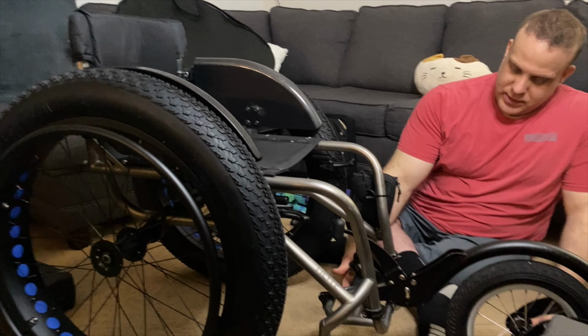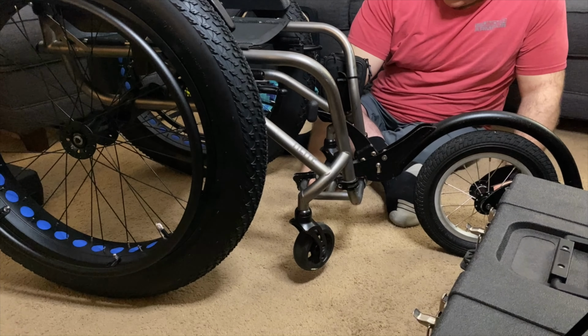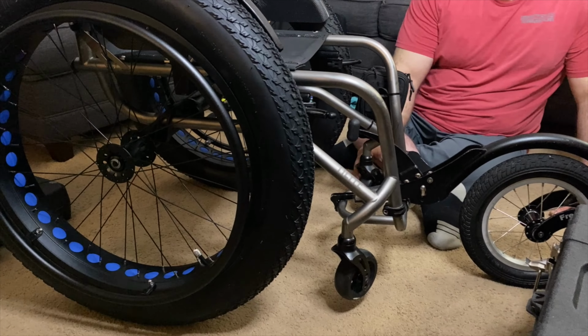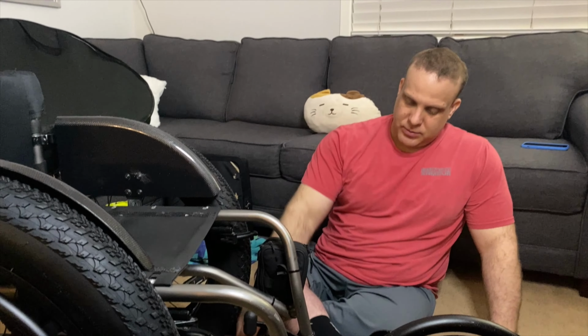Yeah, this has really good clearance now. We're looking at at least an inch between the ground on a flat surface. That'll be great because, as you know, getting on the beach sometimes, with how uneven it can be, these can drag a little bit, but it shouldn't be an issue at all.